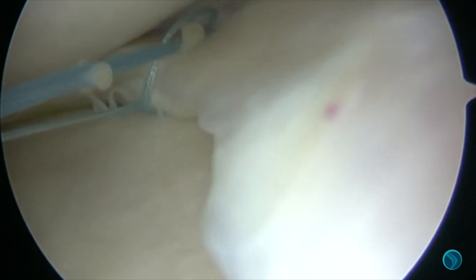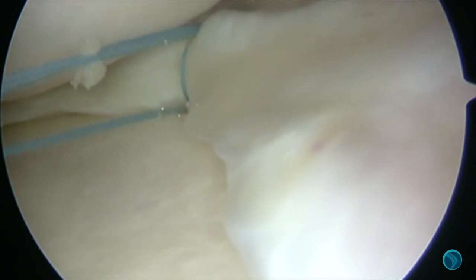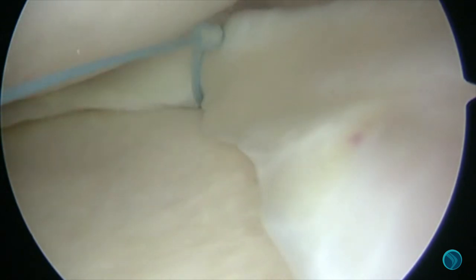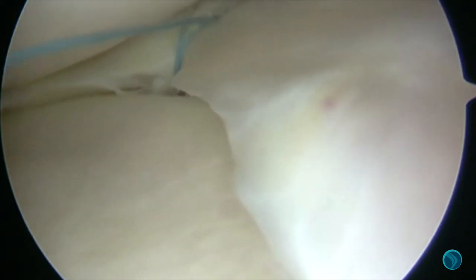We then identified the loop, pulling it to tension the first device, and then pulling on the long string which brings the second suture taut. We then used the suture cutting device, bringing that into the knee and just trimming that off.